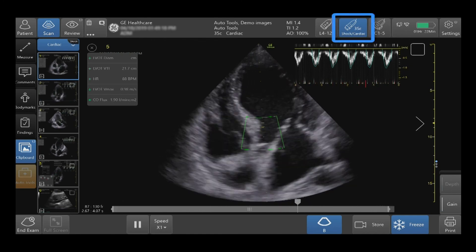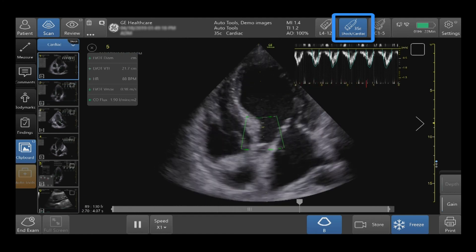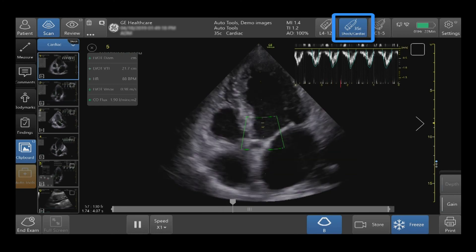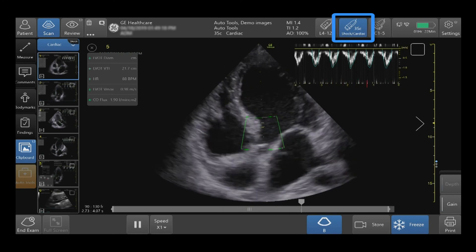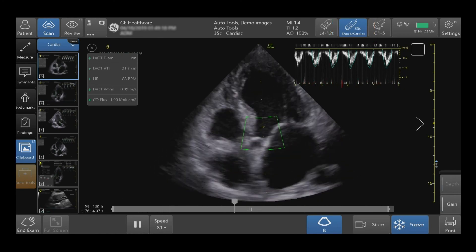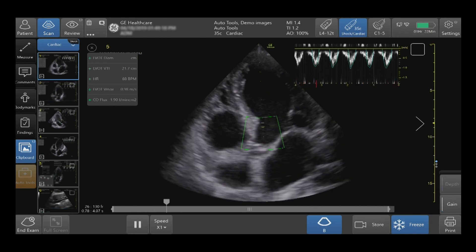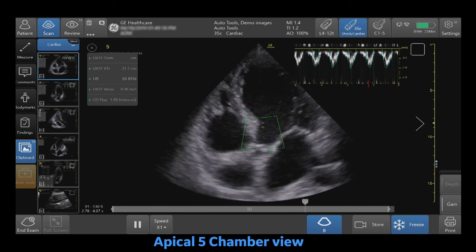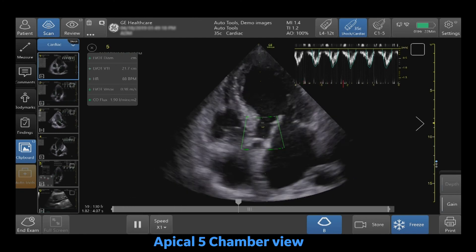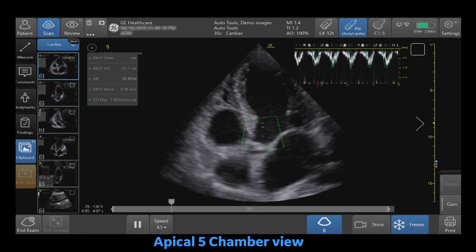Select the correct probe and preset in order to properly use the AutoVTI Auto Tool. In this case, the 3SC probe and the cardiac preset are used. Using B-Mode imaging, demonstrate the left ventricular outflow track by performing either a 3 or a 5 chamber apical view. Here we are demonstrating a 5 chamber view.